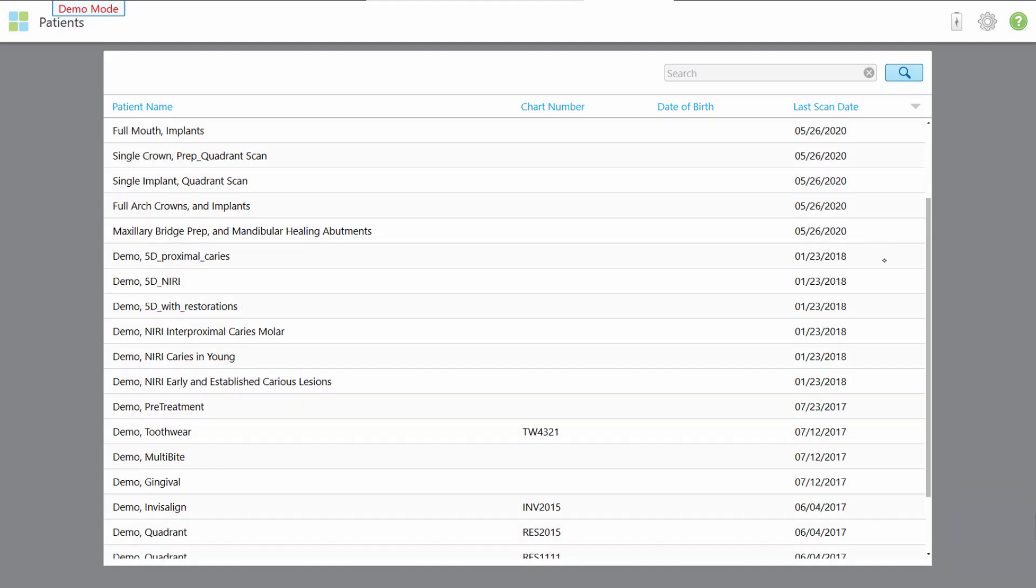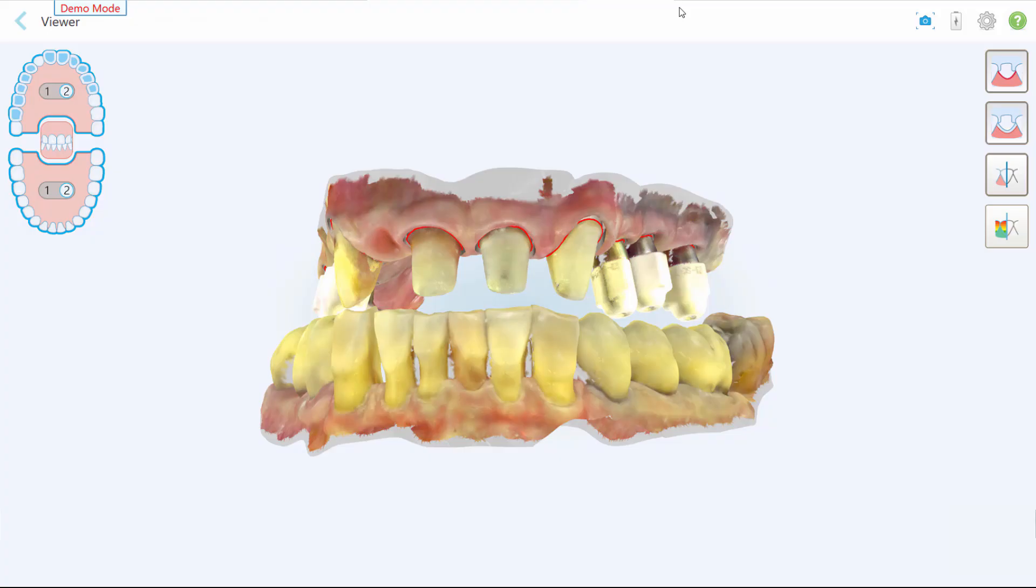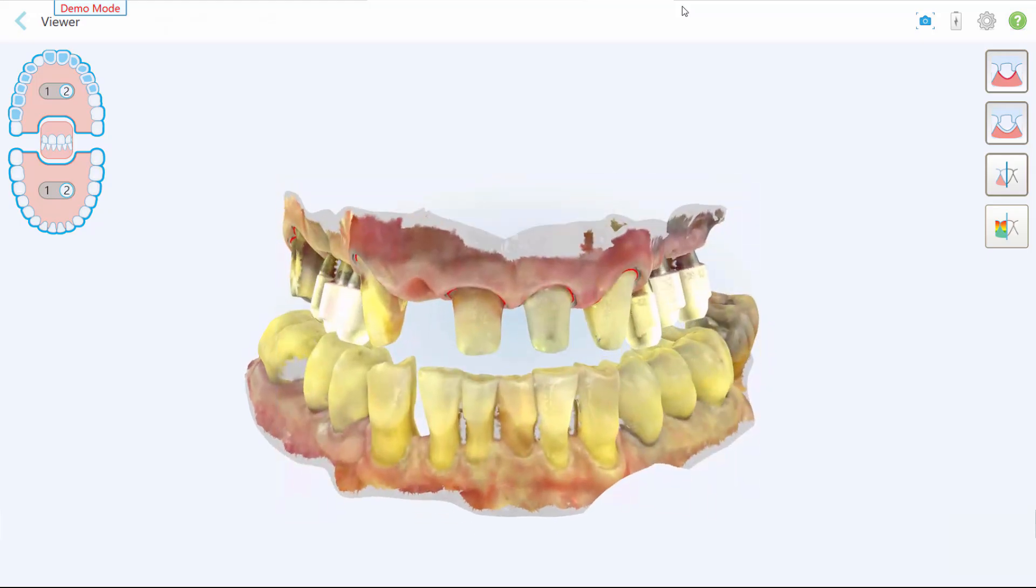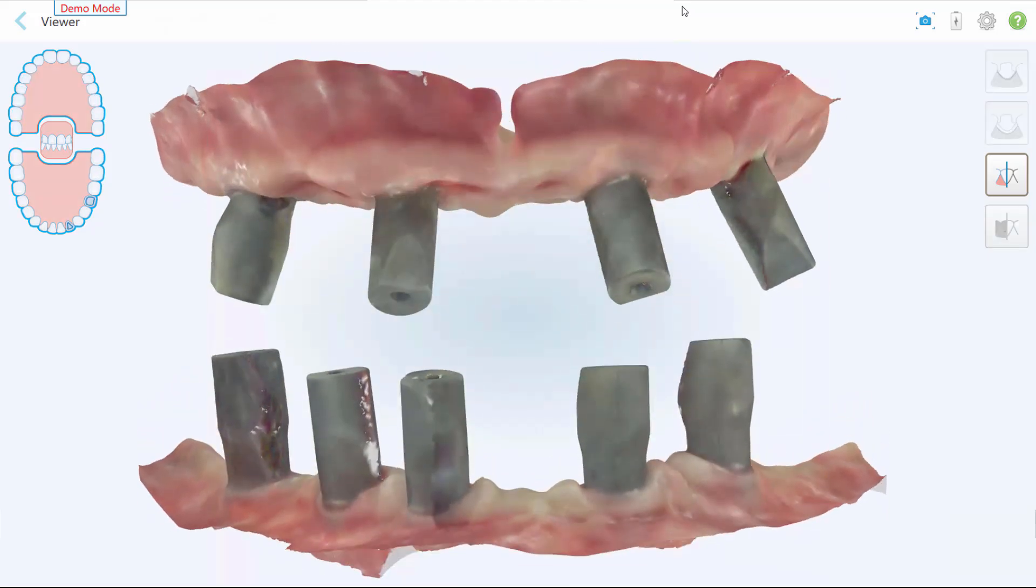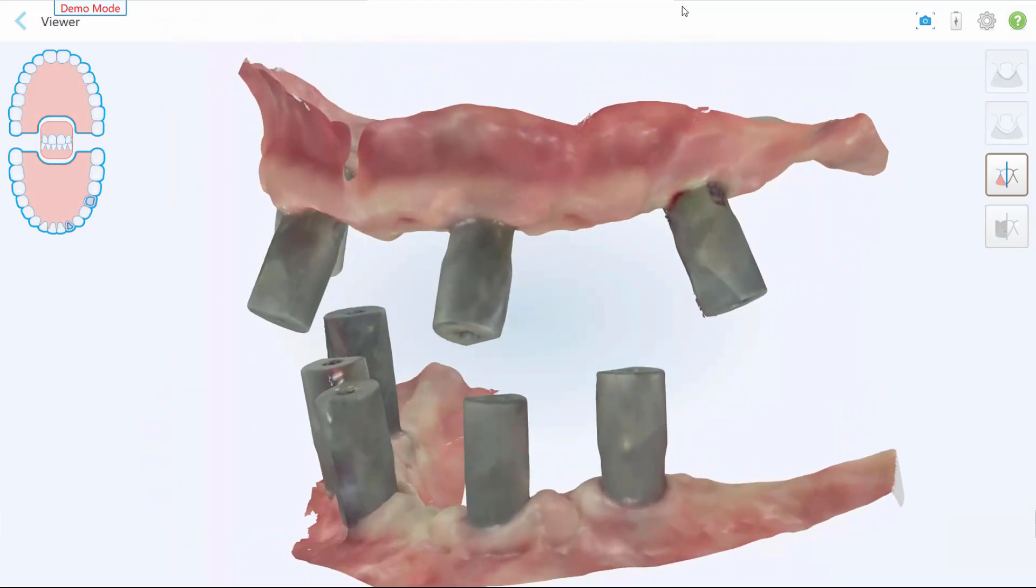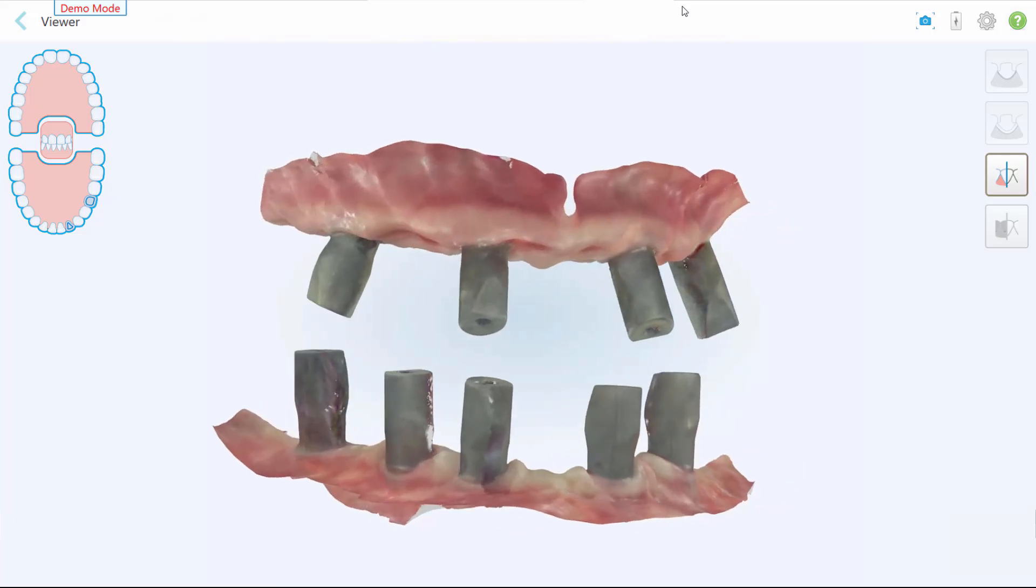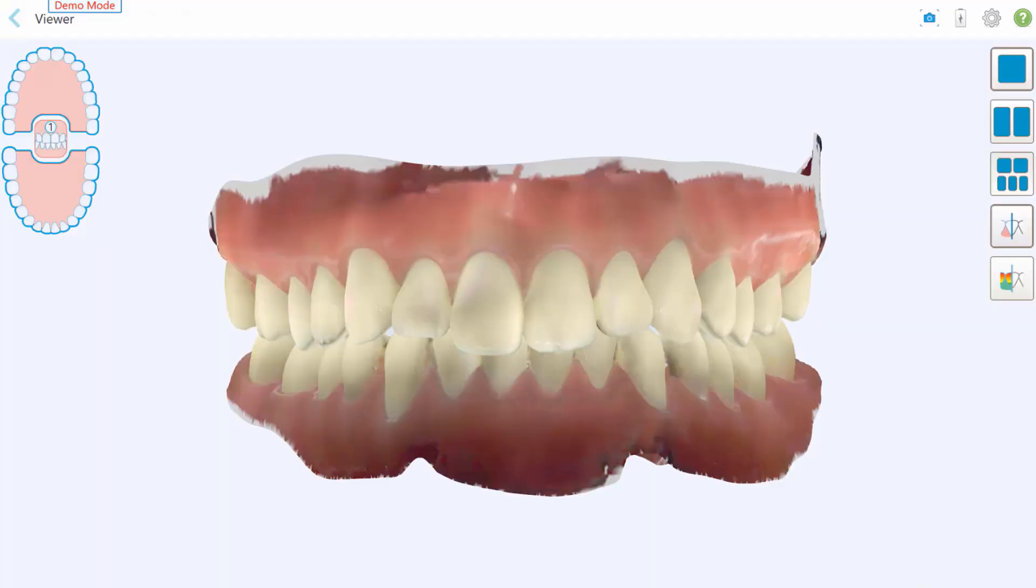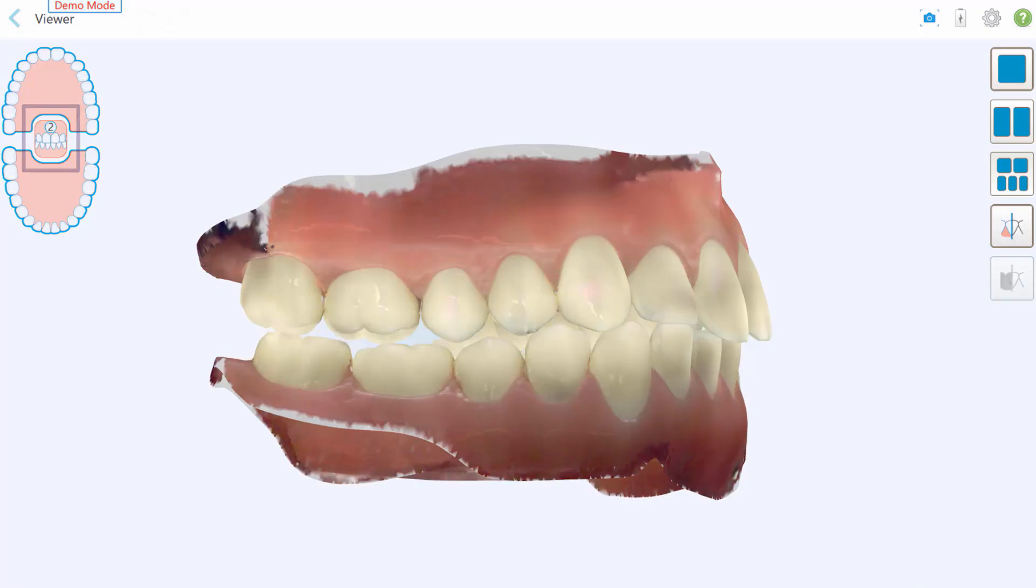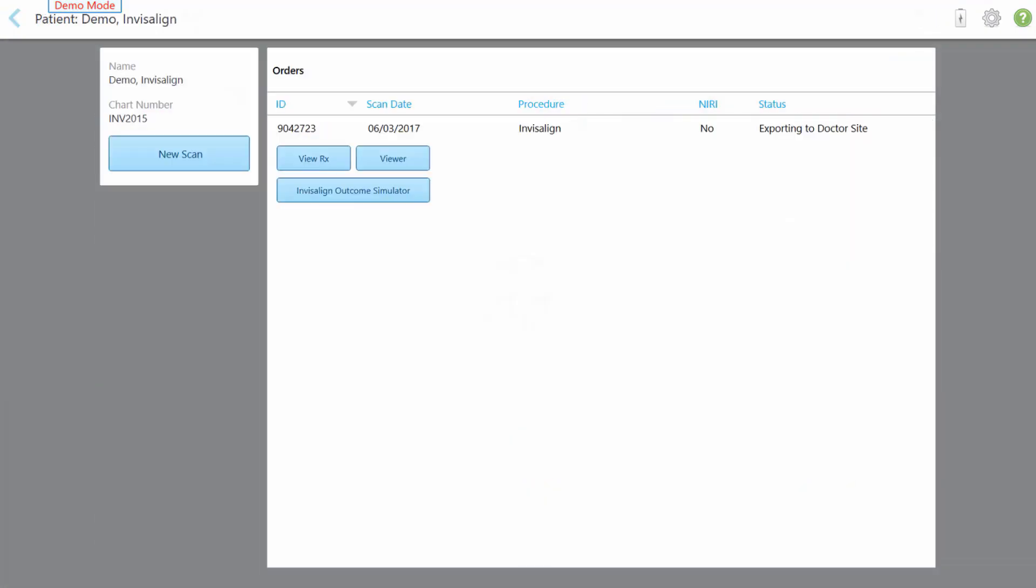Covering restorative, Invisalign, and oral health assessment capabilities, for restorative cases you can explore several examples from single crown to full edentulous. Tap full arch crowns and implants or full mouth implants. Tap demo multi-bite, for example, to see how two different bite relationships can be captured in one case. For Invisalign cases, tap demo Invisalign to view the 3D model in Invisalign outcome simulator.